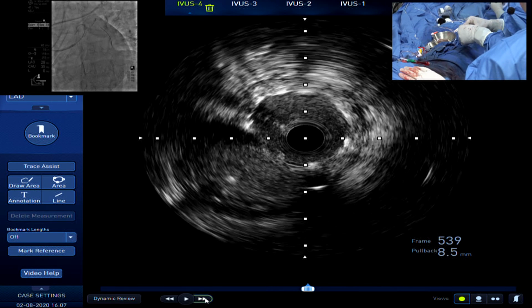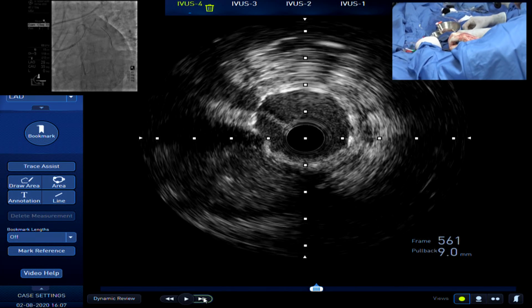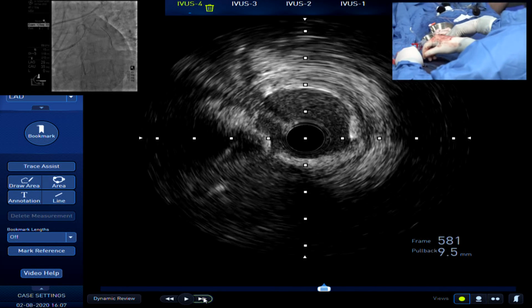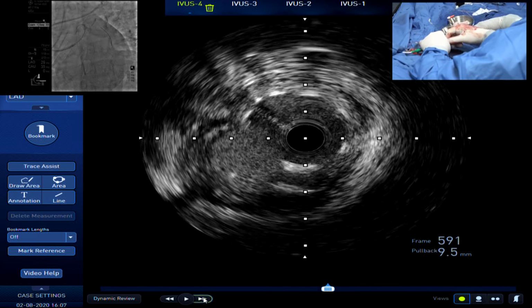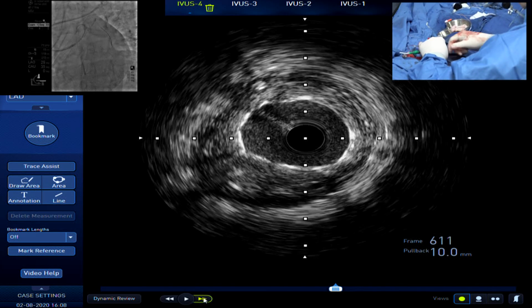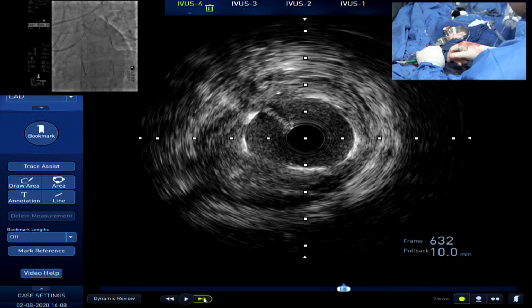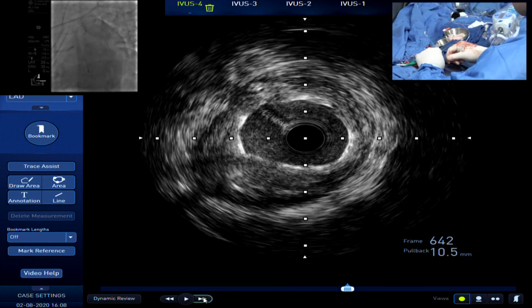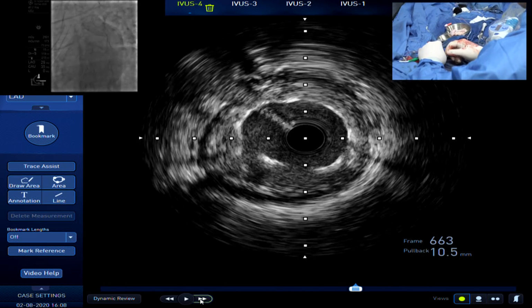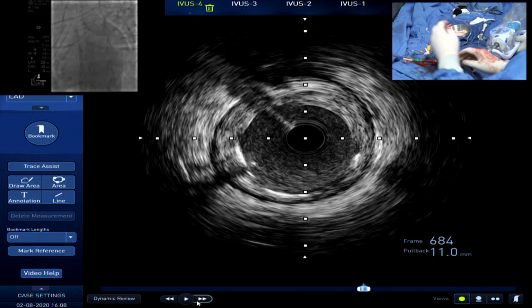So do we have any opinion from the panel about the ultrasound findings? No pericardial effusion. Yeah, it's a very important finding. Distal LAD size increased a little bit and the symmetry became better, and in the proximal part, there is only one strut coming out to the left main, but okay. There is no problem, right?